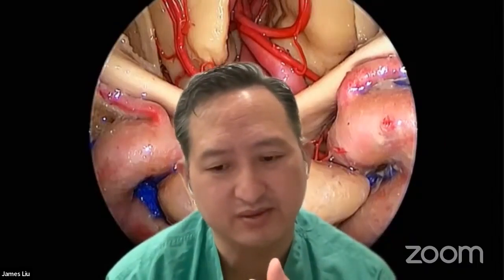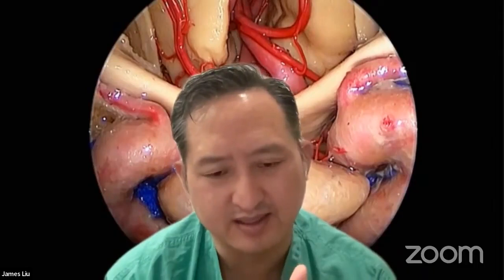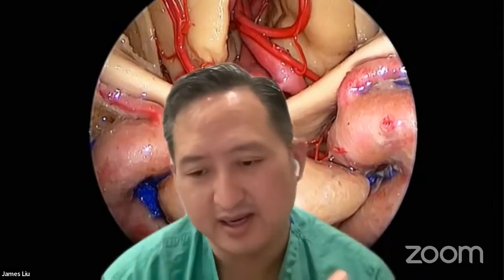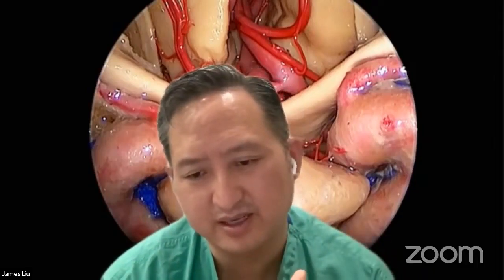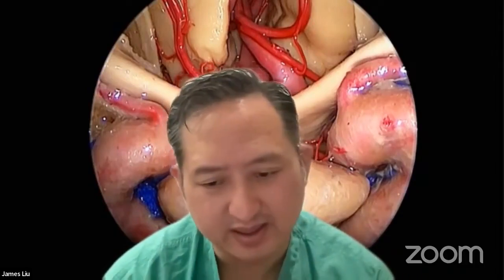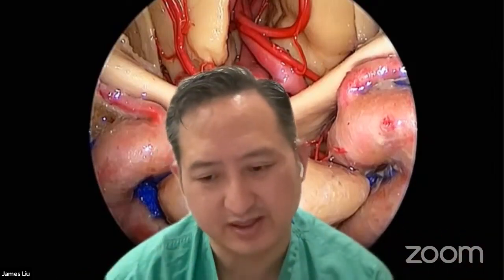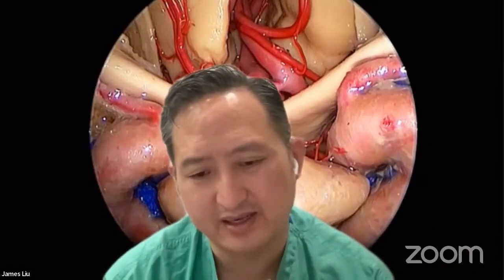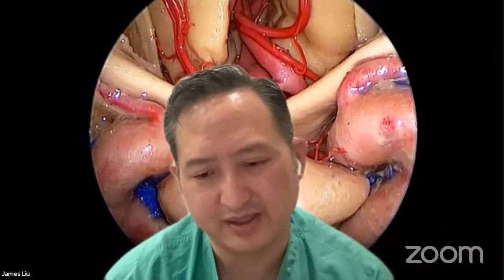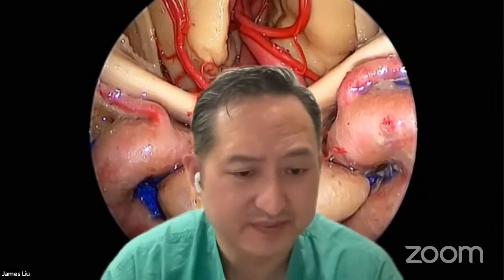I think it's important when you do that to use a multi-layered repair. I like to use autologous fascia lata as the initial layer. Then we use Tisseel, which is a fibrin sealant, as a second layer, more like Scotch tape to seal down the fascia lata, and then use the nasoseptal flap as our final barrier, with postoperative lumbar drainage.